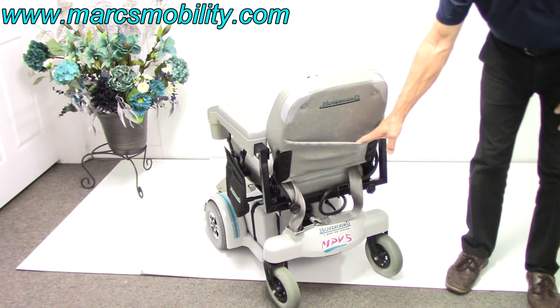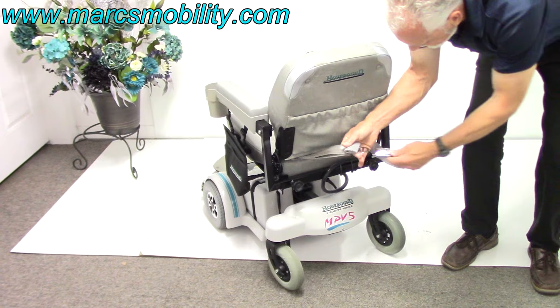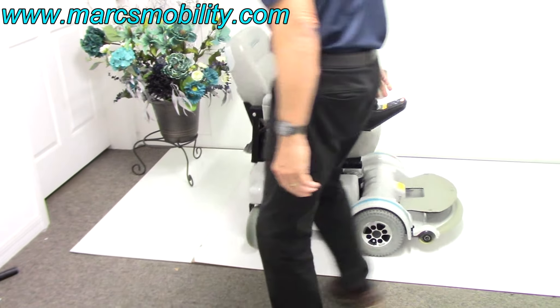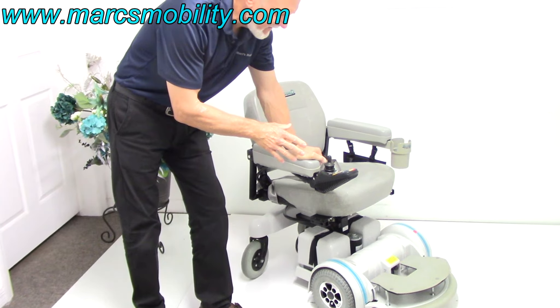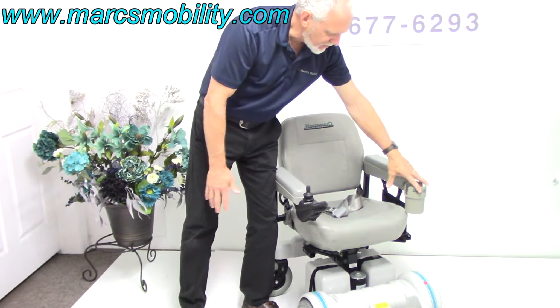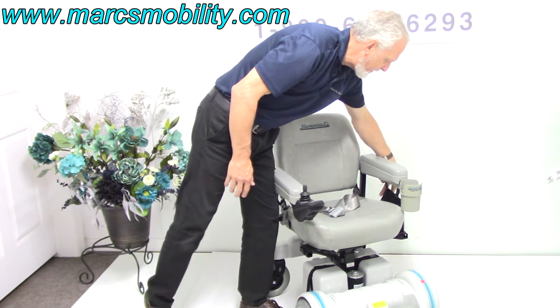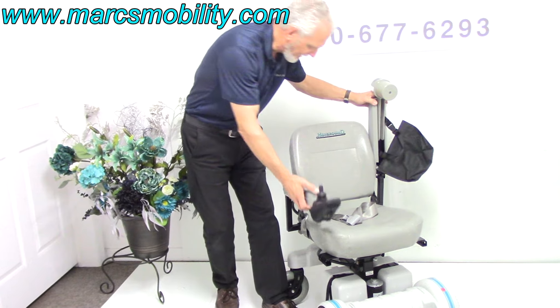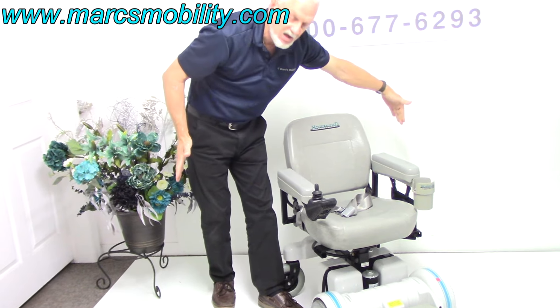On the back of the chair, you've got a pouch and a safety belt. This is a Hover-Round chair — a world-famous chair, and the only chair that's made in the USA. The joystick is on the right; it can be transferred to the left, and we can put the cup holder, which is here, to the right if needed. You have a bag over here, also a Hover-Round bag. The arms go up out of the way if you want to get in from the side, and they also go out if you need more width.